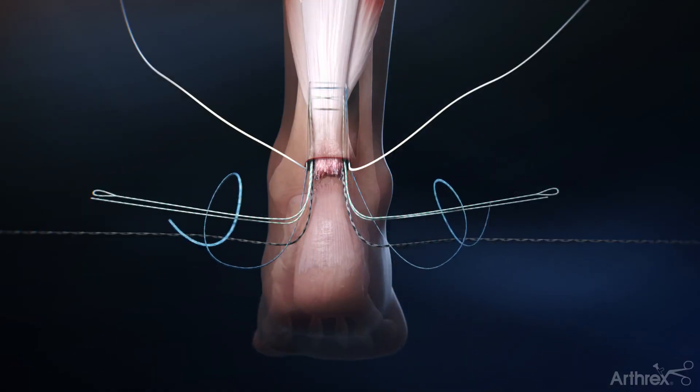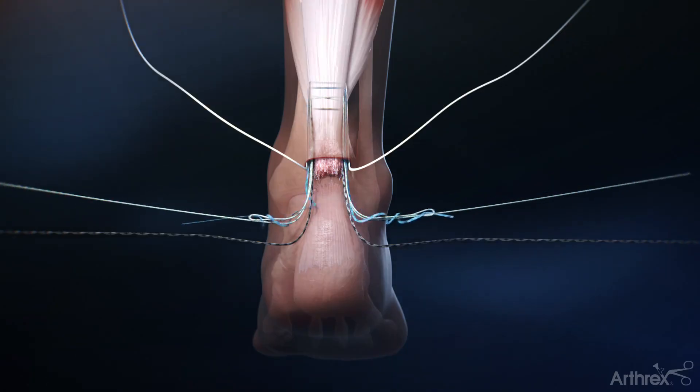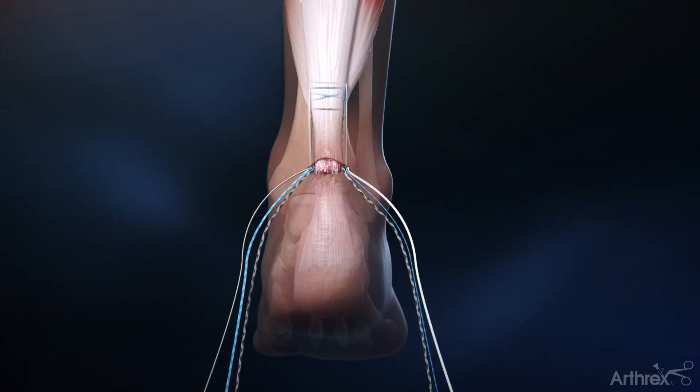On both sides, pass the blue suture tape under and around both green and white fiberlink sutures twice and back through the loop. Then advance each loop back through the tendon using the free end of the green and white fiberlink sutures. This creates the locking stitch.